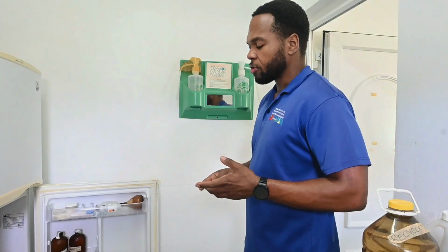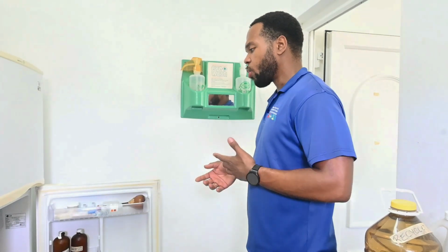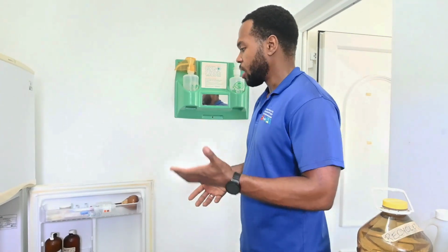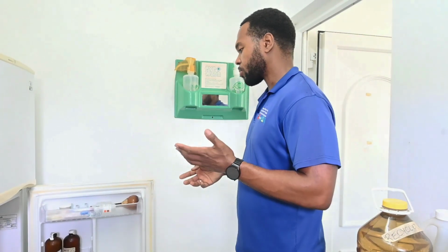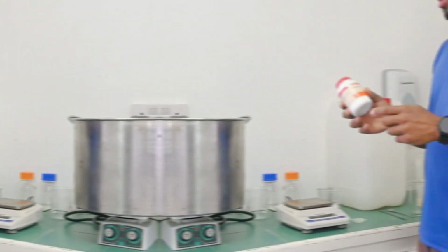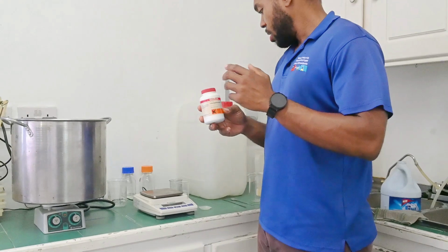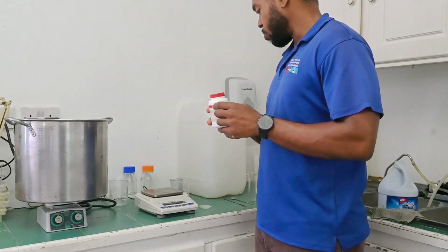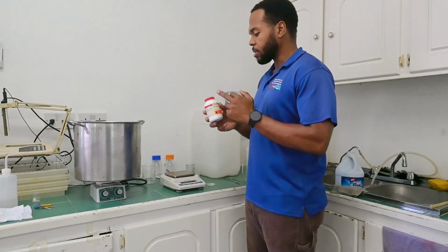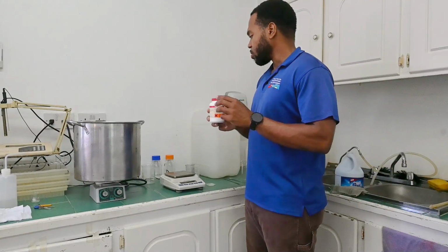So I will show you the process from start to finish, from creating one of the stock solutions to adding all of them, to creating the plant growth medium, to adjusting the pH, all the way to the final process when it is removed and placed into the lab in the growth chamber. Here we have one of the growth regulators, which is benzylaminopurine, and we're going to create that stock solution today. It is 0.10 grams for 1,000 milliliters of water, and it's dissolved in sodium hydroxide.